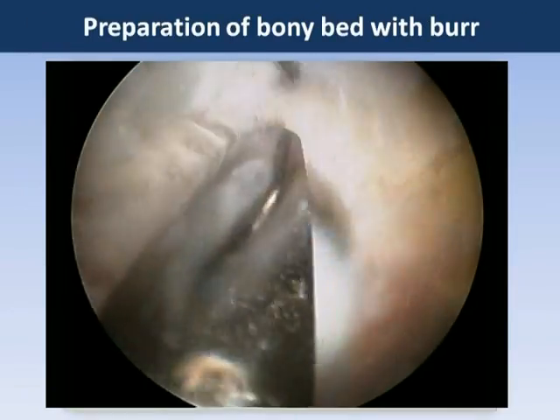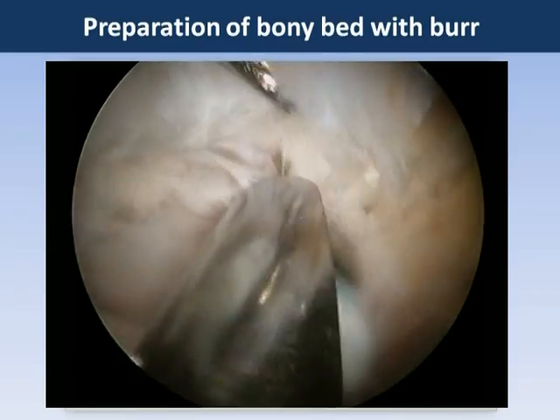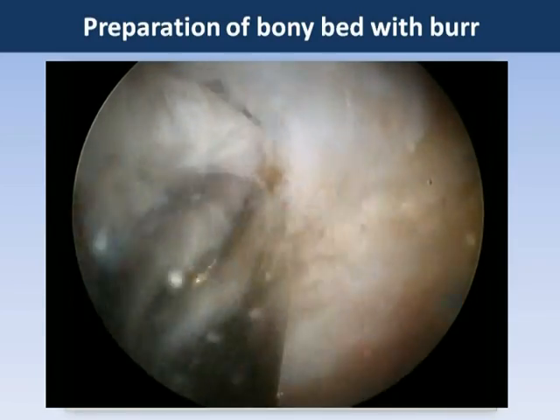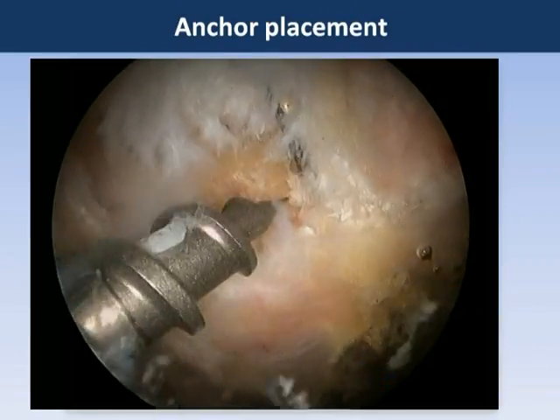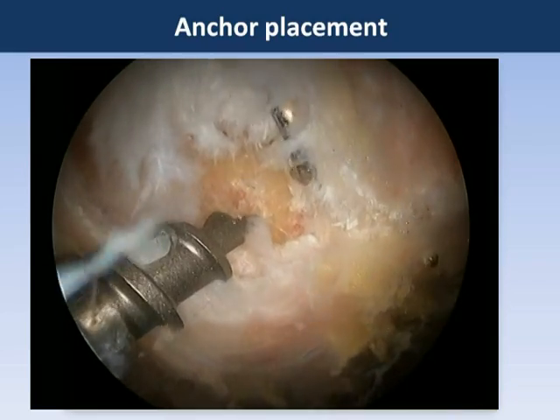We then perform a decortication of the lateral facet of the greater trochanter using a bur to create a bleeding bed of bone for healing of the subsequent repair. It is in this bone that we will place our anchor.